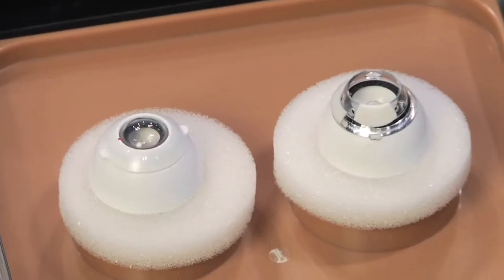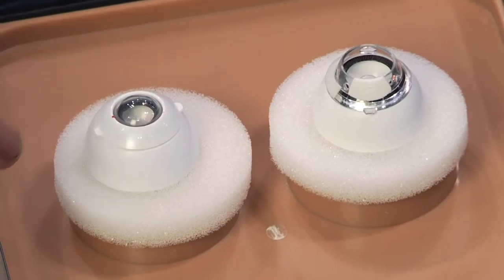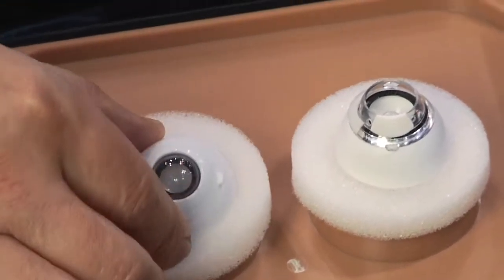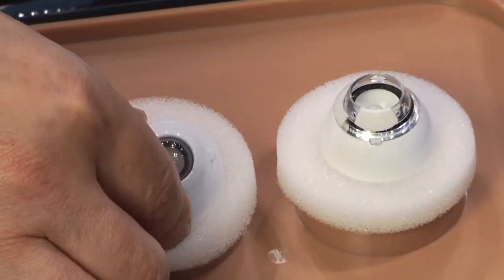The scleral shell attaches to the corneal shell and the special design of the base allows for ocular mobility. This ocular mobility is what gives the Kataro system such a high degree of likeness to the human eye for the surgeon.